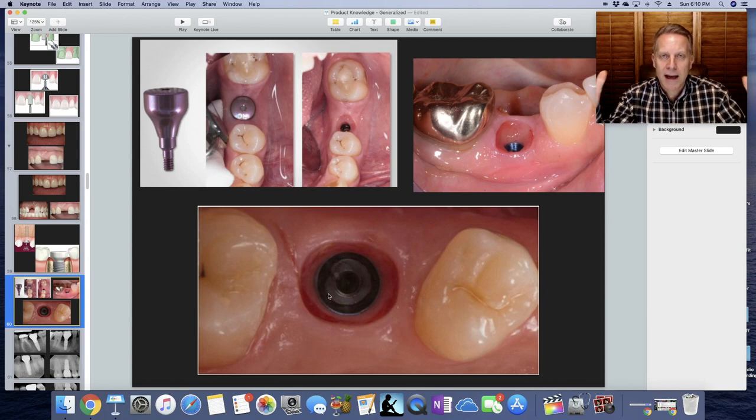Here's another one — you can just tell it has that conical shape so that when the crown goes in, it just looks like it sets right into the gum line.